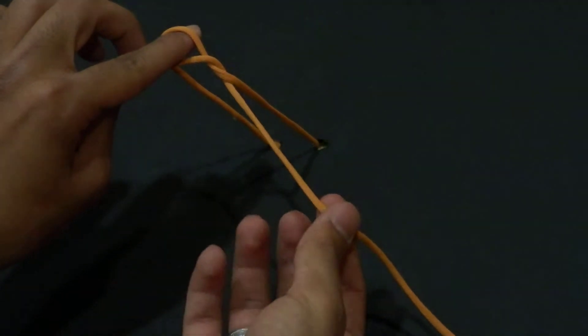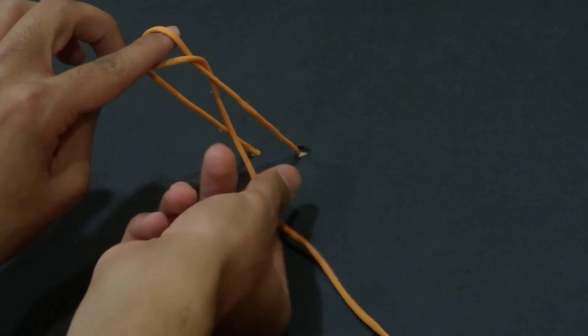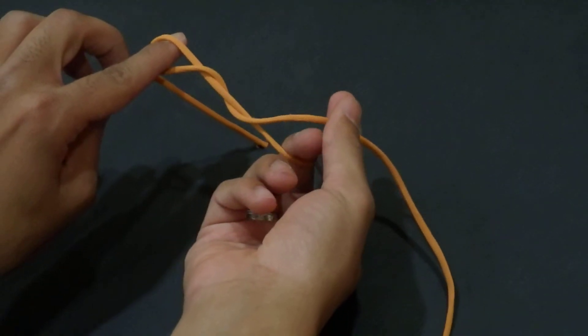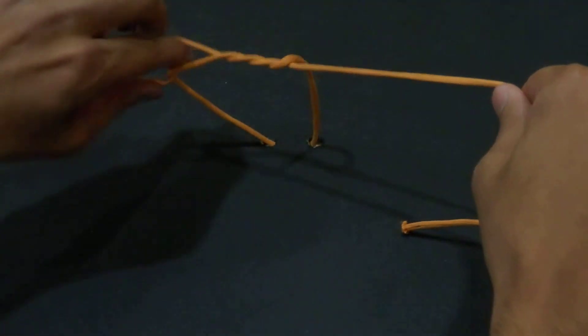I will hold it from below and I will consider this fixed thread as the other part for my knot. So I will hold it from below, take the thread, and bring it inside.